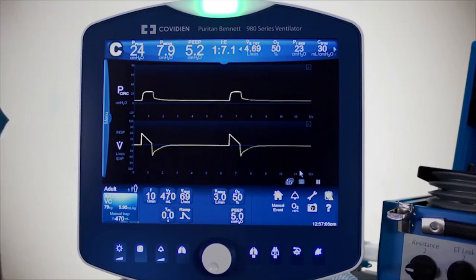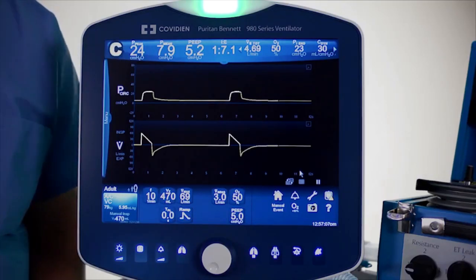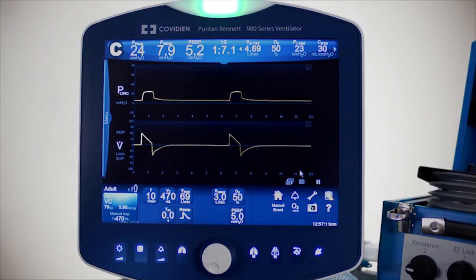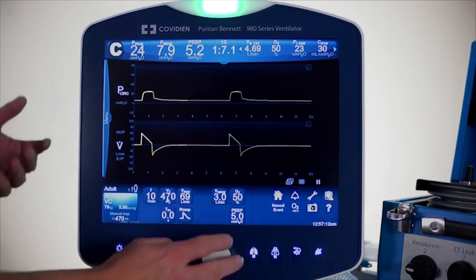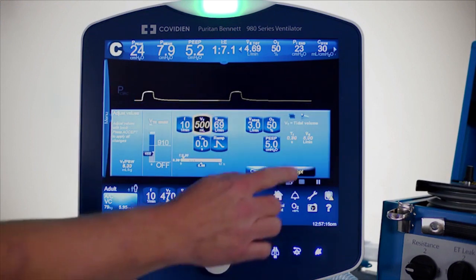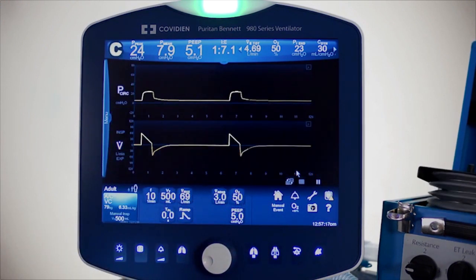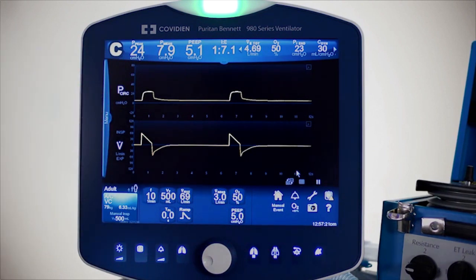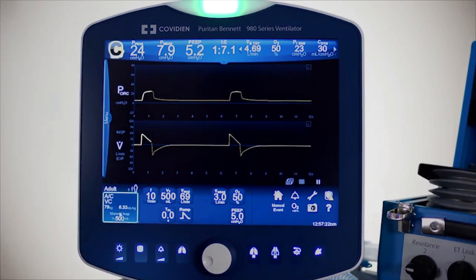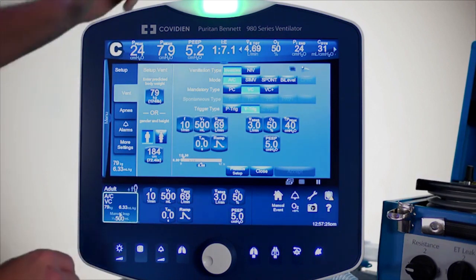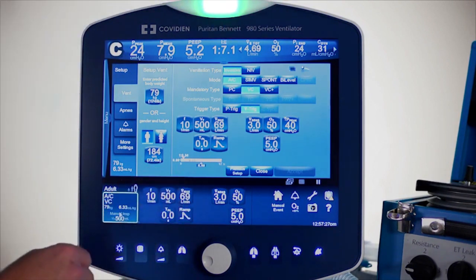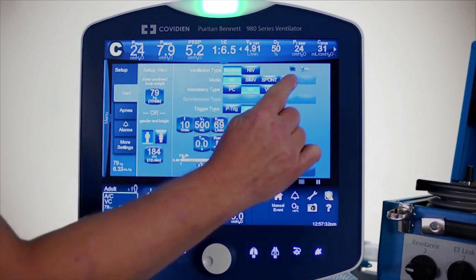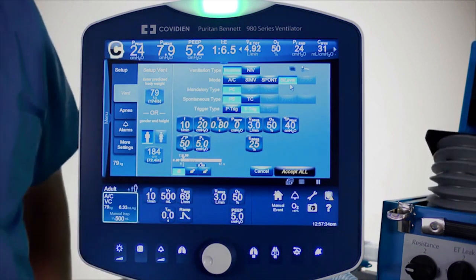Let's look at the actual software. Currently starting in volume control ventilation — for example, if someone was converting over, they may look and say their target was 500 milliliters and want to consider that as a reference. Starting under the Vent Setup button, bi-level works from neonates to adults but only invasively. Selecting bi-level as a mode here.